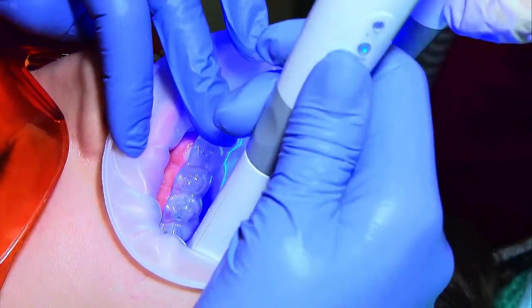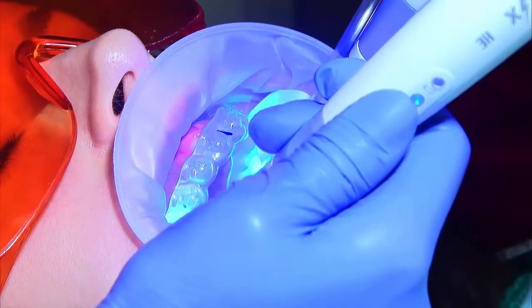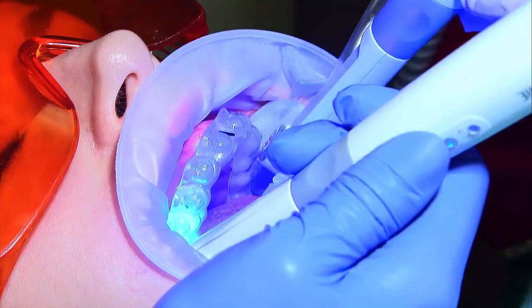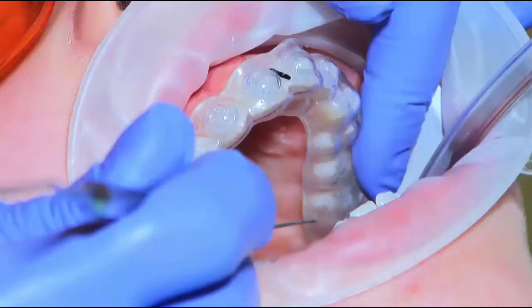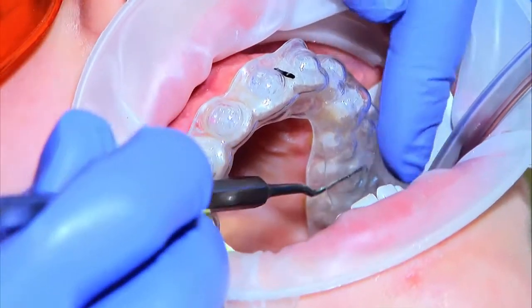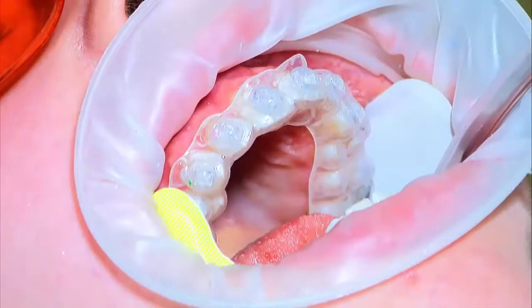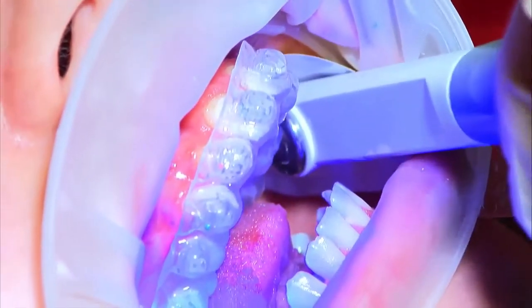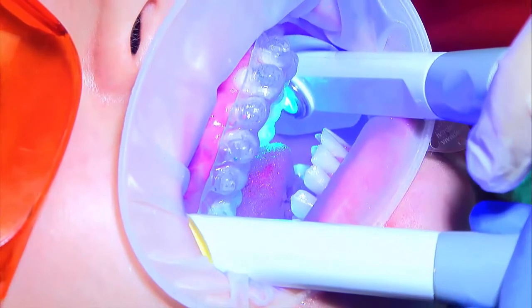You can use two curing lamps simultaneously to shorten the process. Continue curing the rest of the teeth as indicated, and be sure to use the light shield on the curing light or protective eyewear. Now is the time to release the hard tray. Place the scaler inside the grip point in the back and push downwards. Once you have the initial disengagement, use your fingers to entirely remove the tray. Repeat the entire curing cycle again — 10 seconds occlusally and 10 seconds gingivally per tooth — performing each step in the exact same order as before.